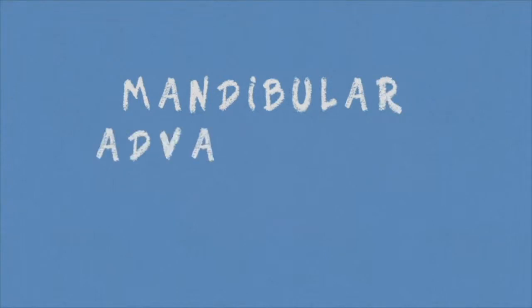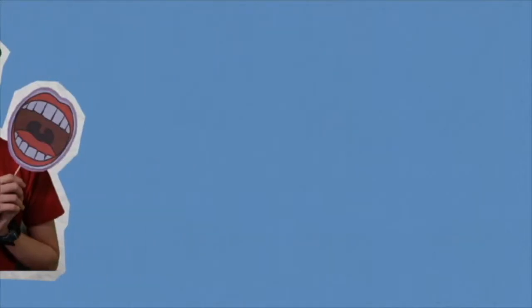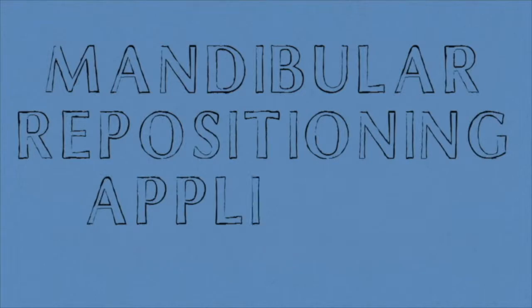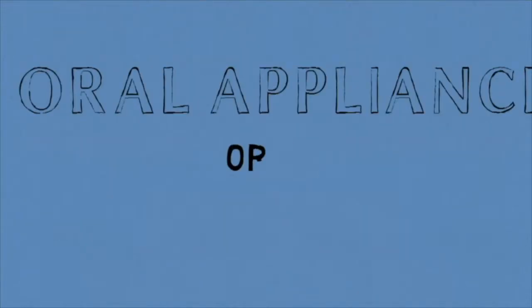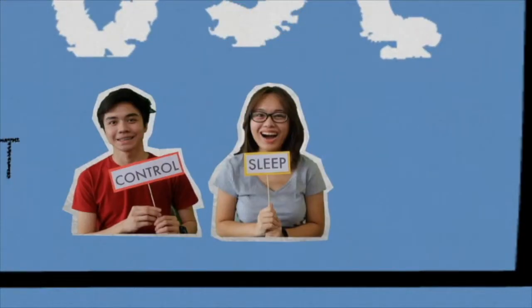But first, let's define mandibular advancement device. Generally, it is a dental appliance similar to a gum shield which is worn in your mouth while you sleep. These can also be called mandibular advancement splint, mandibular repositioning appliance, oral appliance, or dental device. The purpose of these devices is to serve as a treatment to control sleep apnea.